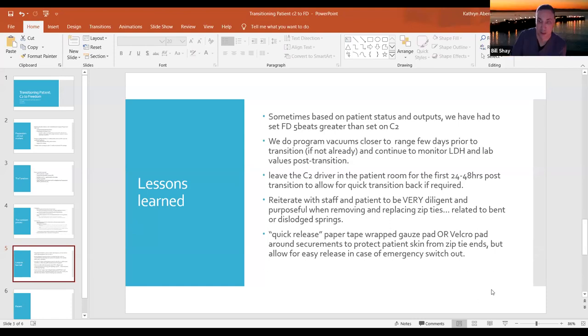Any other questions? Catherine, a couple of questions came up about how you clinically monitor your patients with the biomarkers, LDH and TEGs. Can you speak a little more to why you use both, or why you use TEG over LDH monitoring?